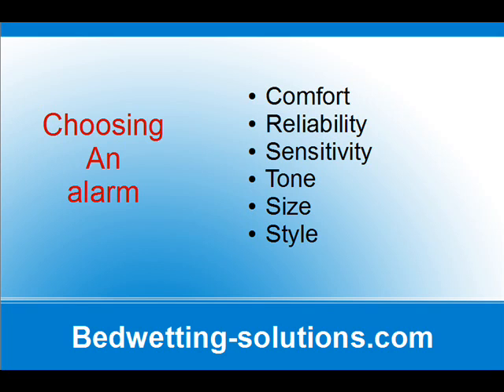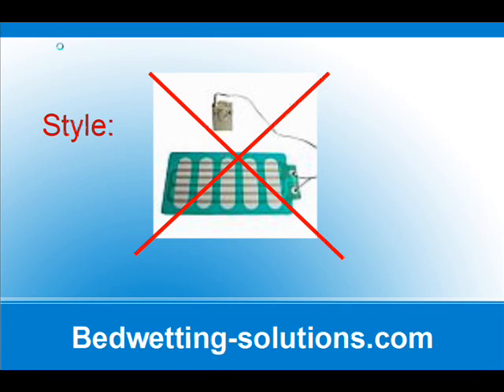First, let's talk about the moisture pickup. There are two basic choices: bed pad and moisture sensors. The bed pad designs are meant for use in nursing homes, not for children. There's almost no chance that a child will be lying on that hard little mat when it's needed.